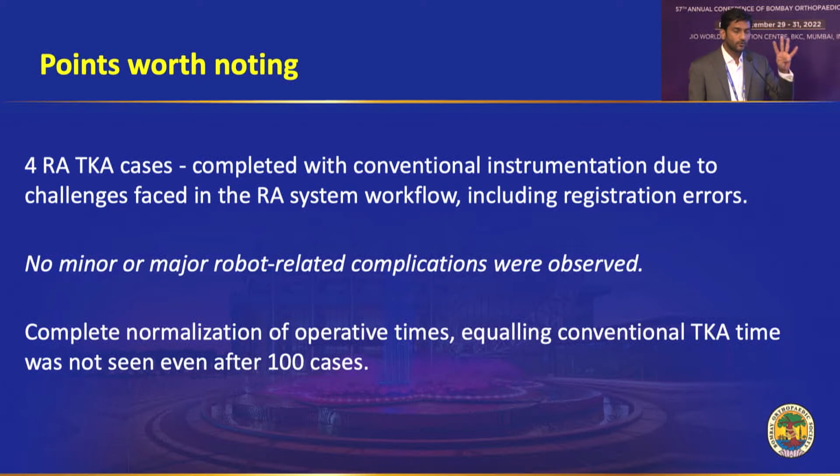Points worth noting, in 4 cases the system went wrong, so I had to convert to conventional. No complications as such were seen in the first 100. And I couldn't really match my conventional times with the robotic system even after 100 cases.